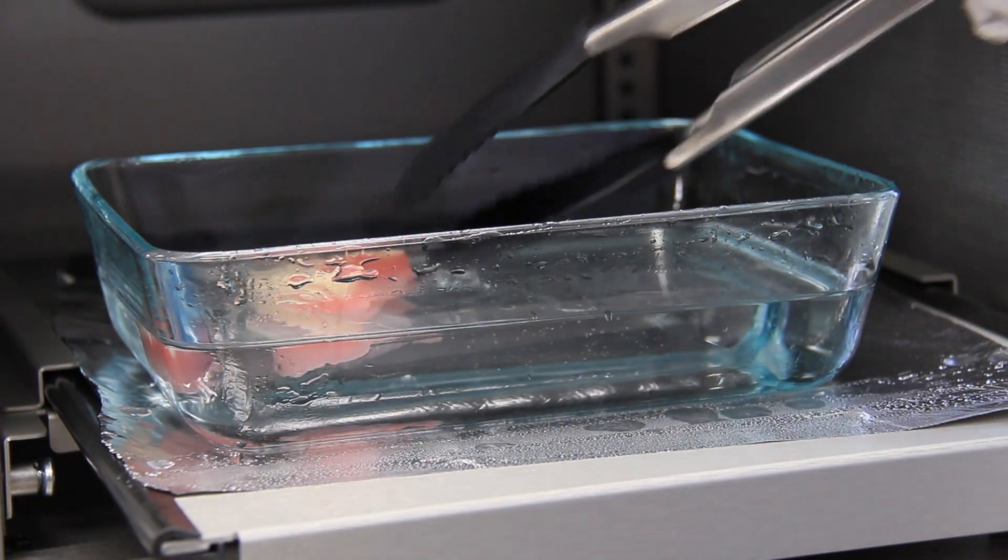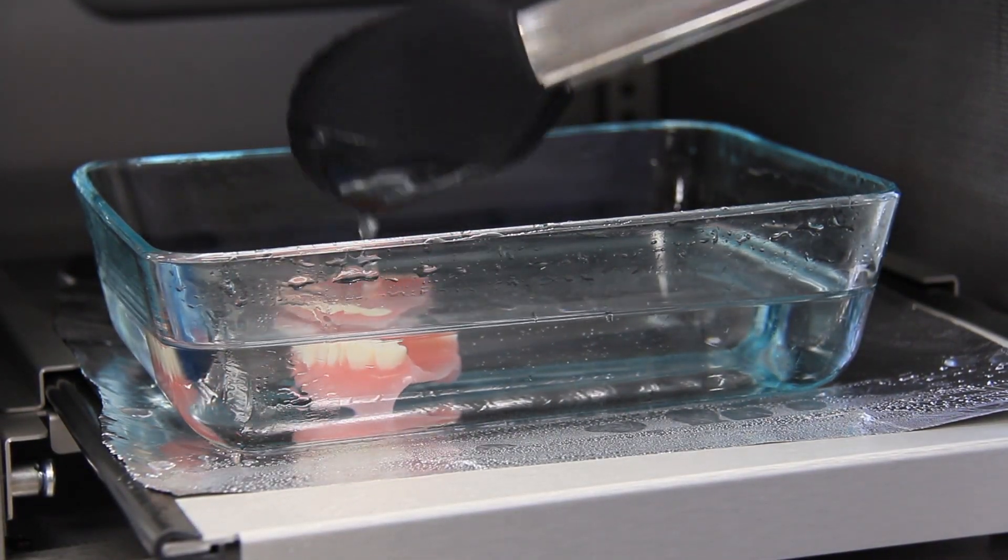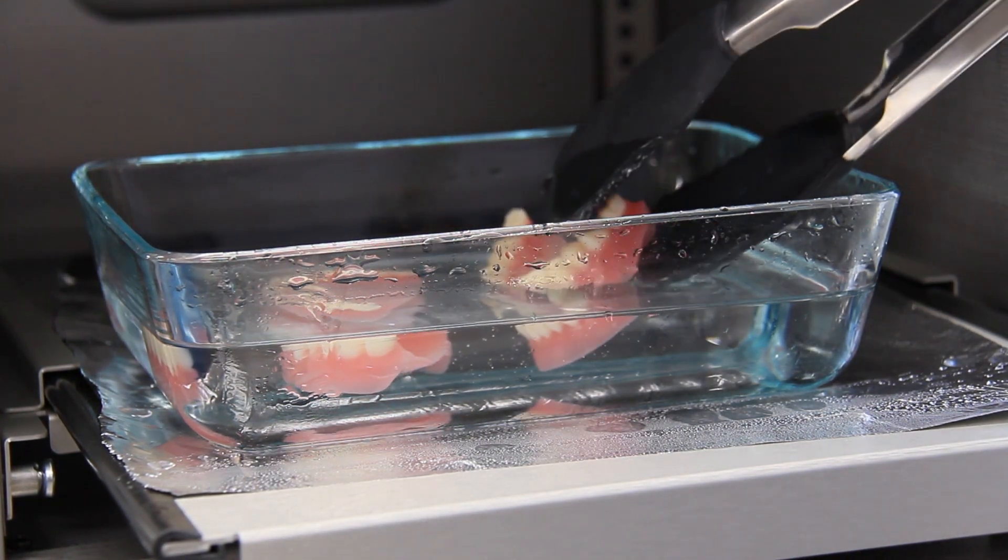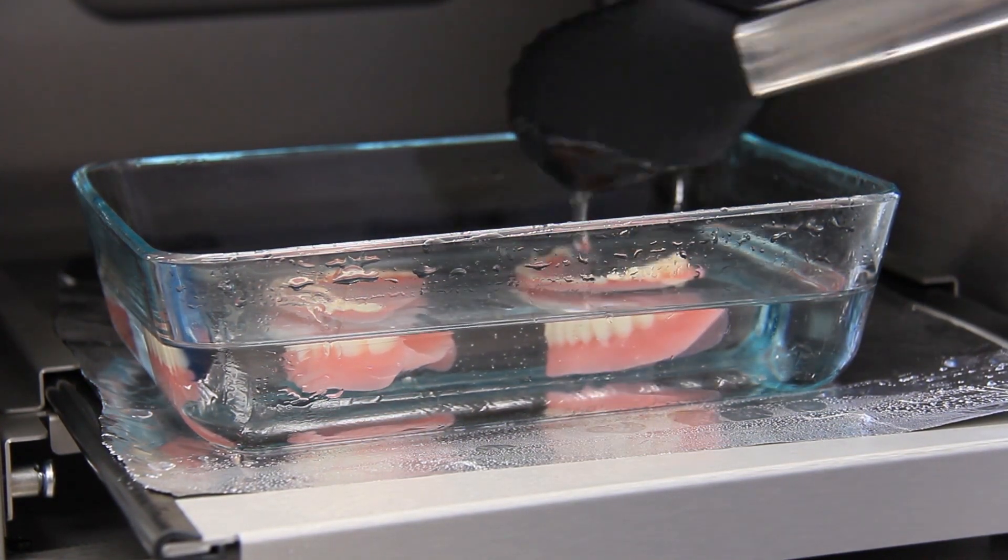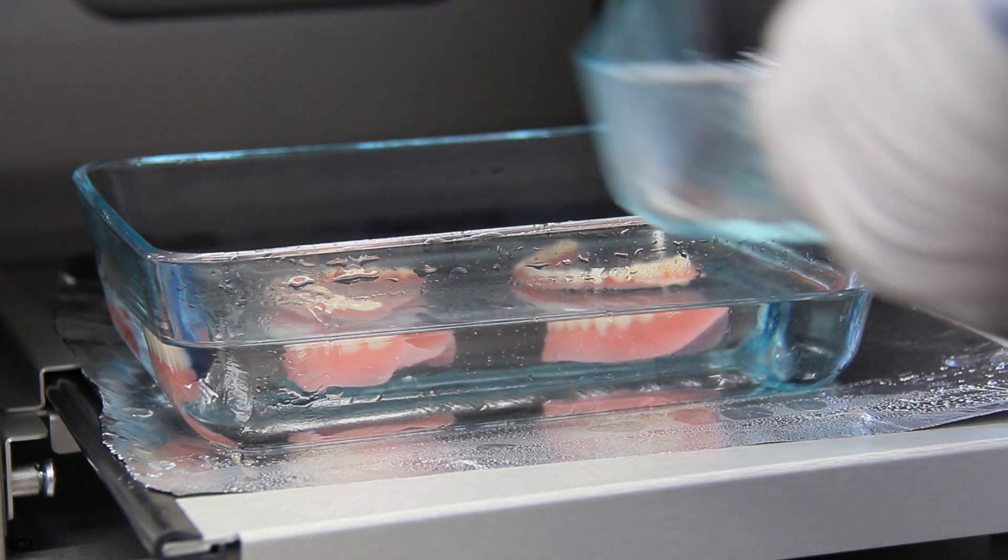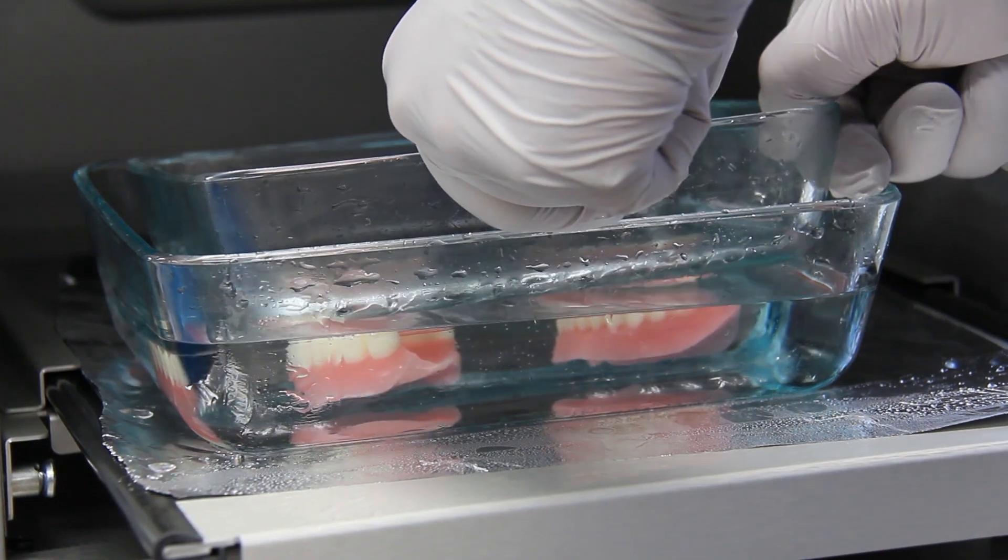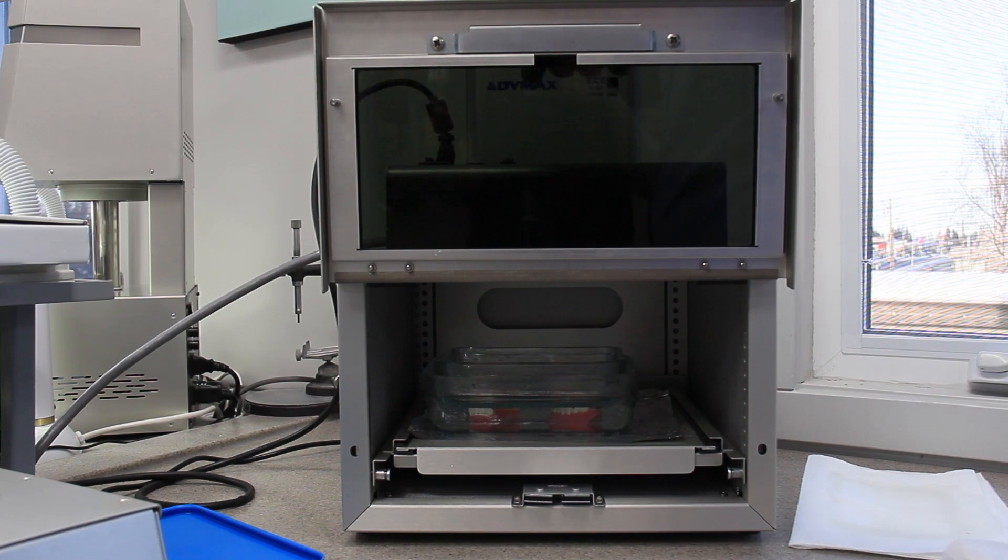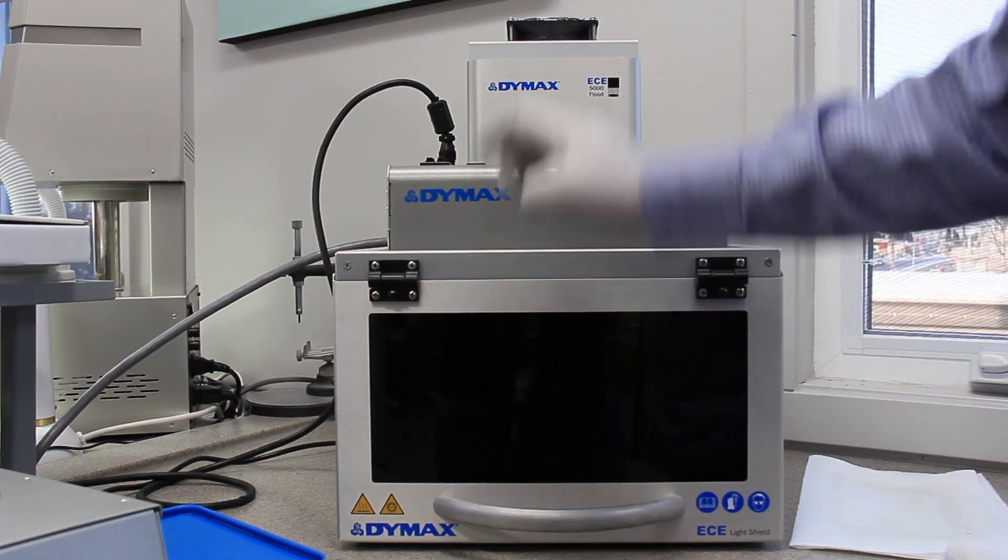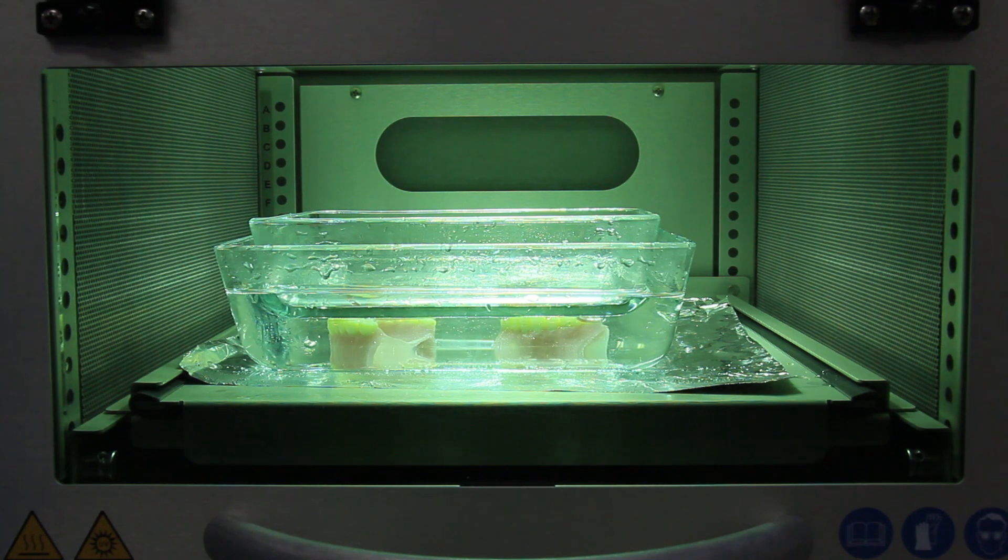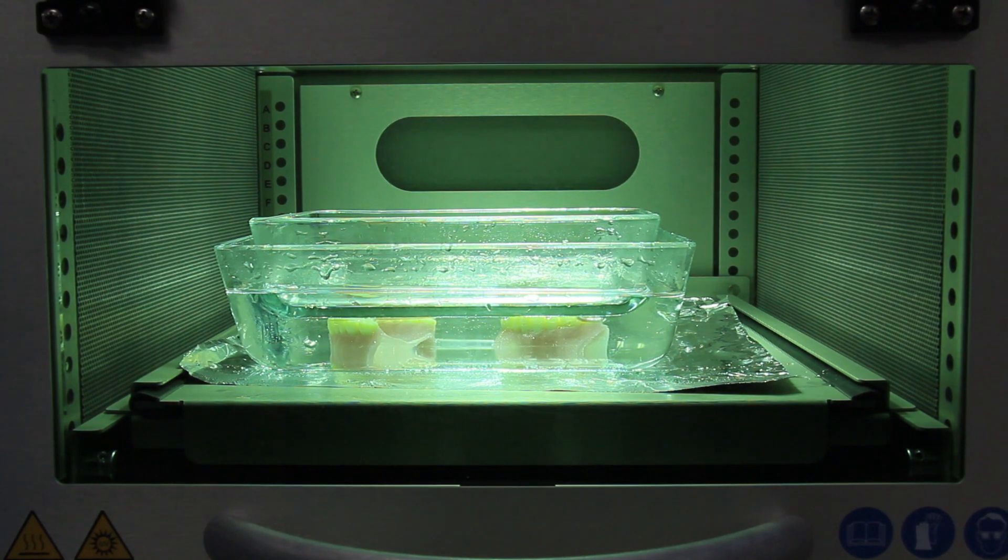Next, the dentures must go through a final curing process. This is achieved with a very powerful ultraviolet light. During the curing process, the dentures are submerged in a hot glycerol bath. The heat from the bath will help the resins to cure fully, while the glycerol prevents oxygen from reaching the surface of the dentures, which might hinder the curing process. This final cure ensures that the acrylic resin is fully polymerized and safe to use in the mouth.